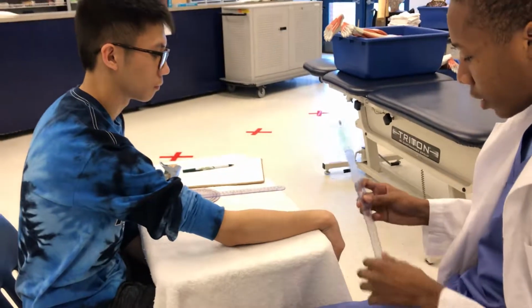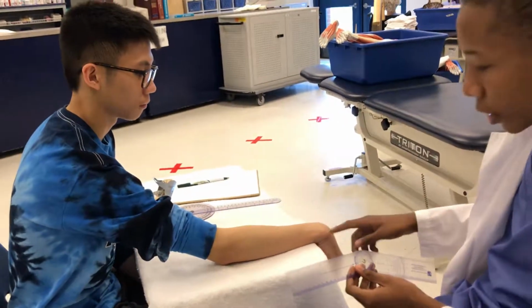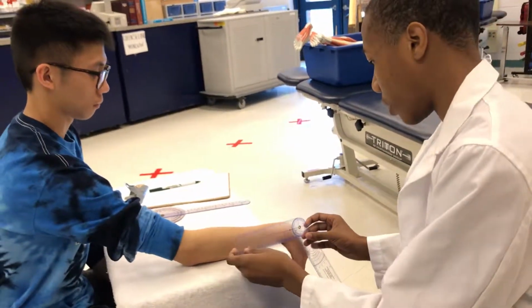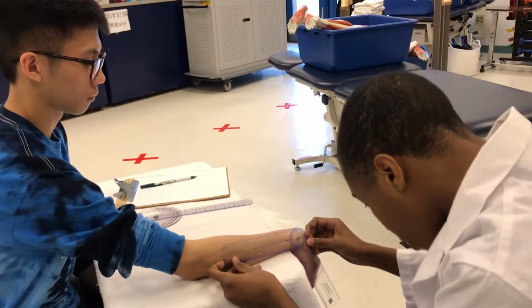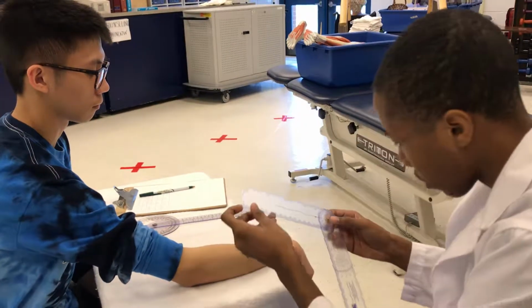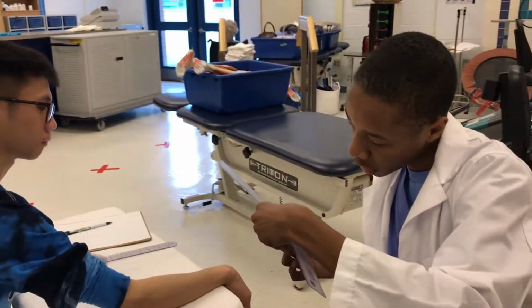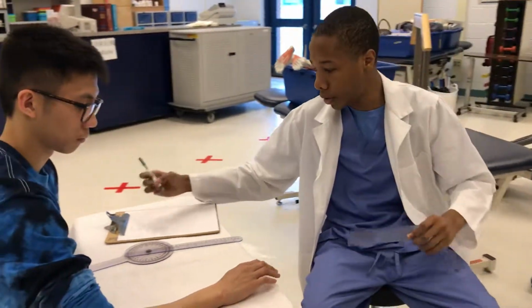I'm going to line up the stationary arm along the ulna, the axis with the ulnar styloid process, and the movable arm with the 5th metacarpal. Alright, so the patient had 70 degrees wrist flexion, which is normal, 70 degrees.